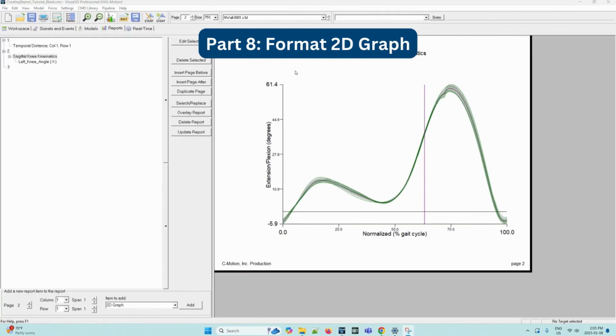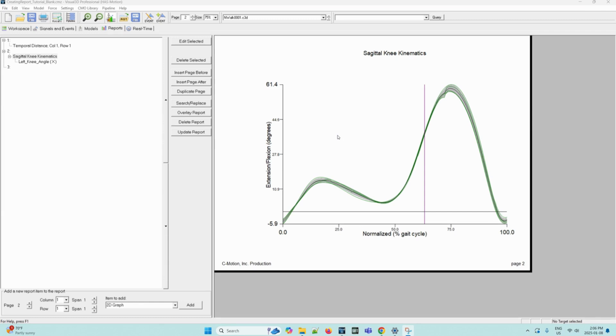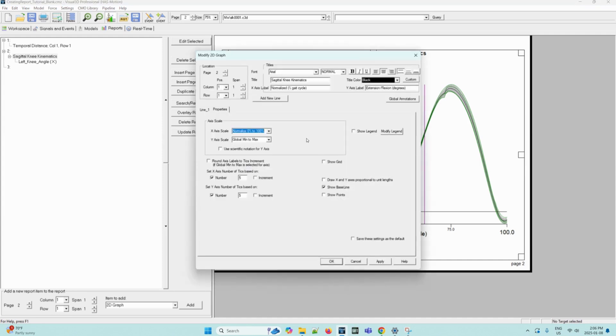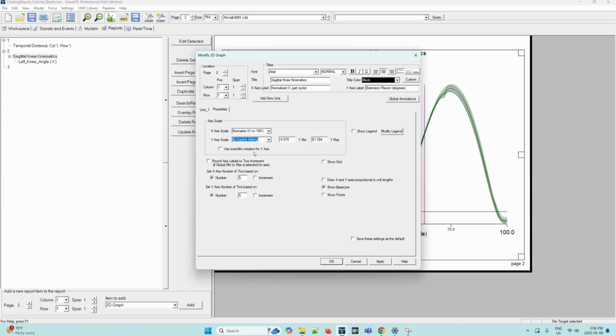Now we can move on to formatting the 2D graph. We can select the graph by left clicking on where a box will appear on the desired graph that we've chosen. Then we can right click for the context menu to open and select format graph here. Now this modified 2D graph dialog box will open. Select by explicit setting from the Y axis scale dropdown. And then the Y min value will be negative 12. And the Y max value will be 70.